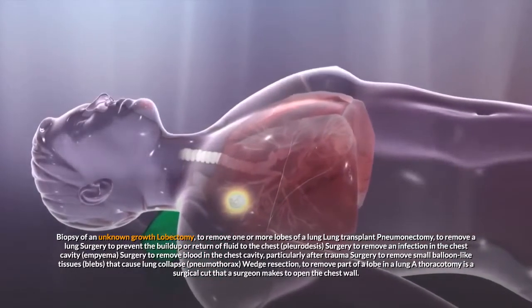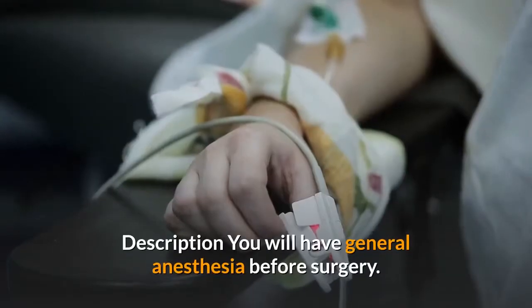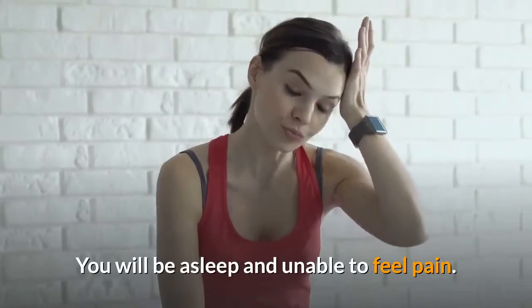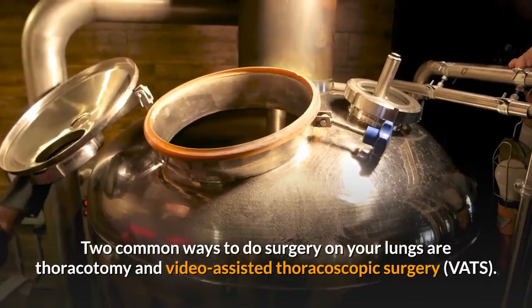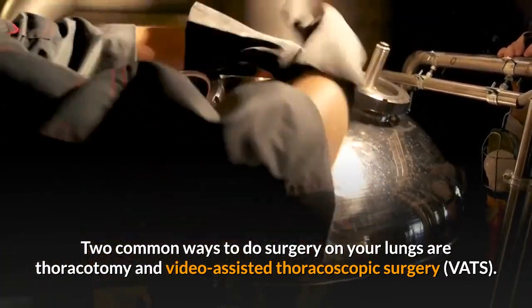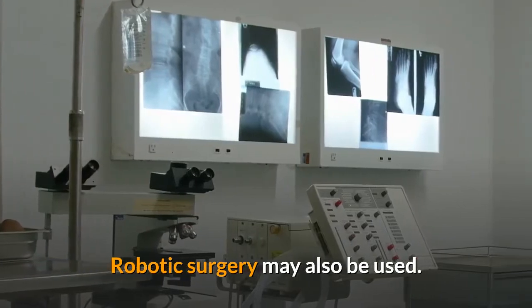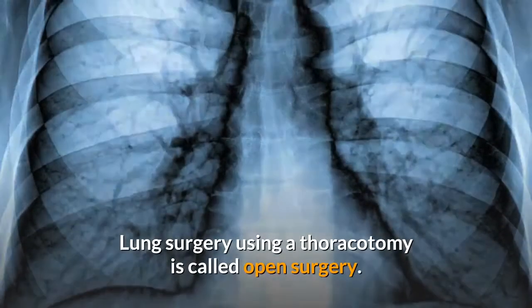Wedge resection is used to remove part of a lobe in a lung. A thoracotomy is a surgical cut that a surgeon makes to open the chest wall. You will have general anesthesia before surgery and will be asleep and unable to feel pain. Two common ways to do surgery on your lungs are thoracotomy and video-assisted thoracoscopic surgery, or VATS. Robotic surgery may also be used.